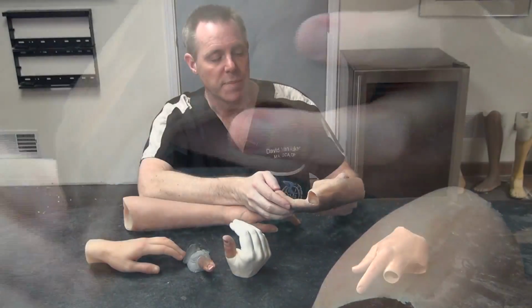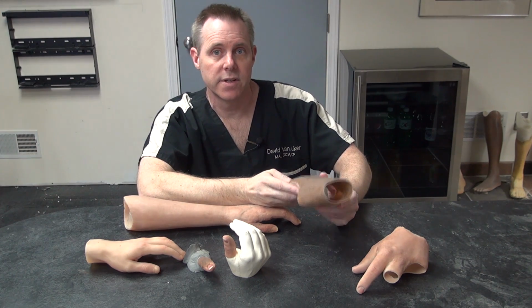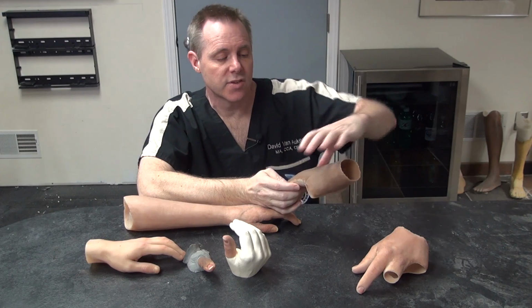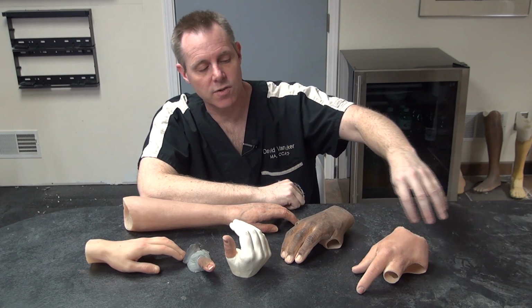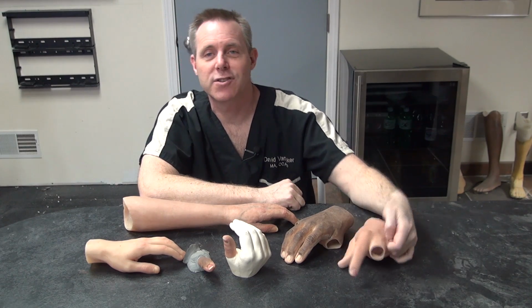This is a hand-carved piece because he had an unusual shape, so it worked better to try and do this by hand to get a desired result. Because color is really, at the end of the day, the most important thing, and that's why we push things like internal coloration and getting a good match, because it's kind of like camouflage.